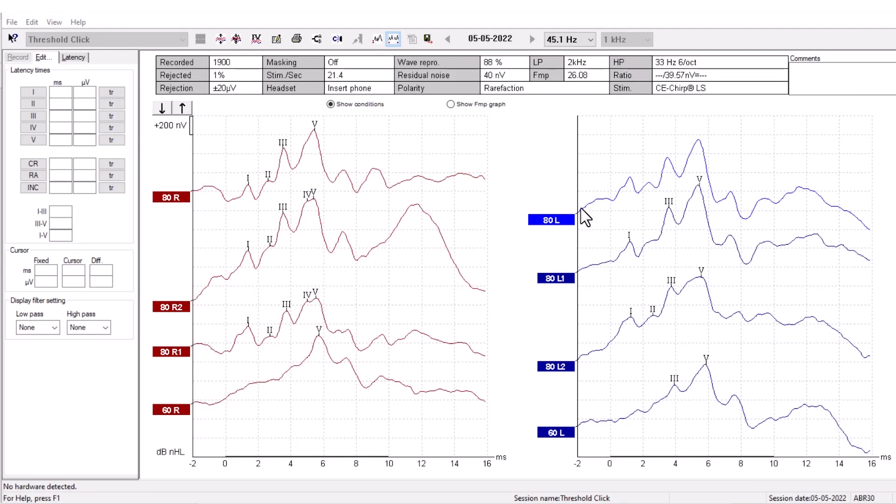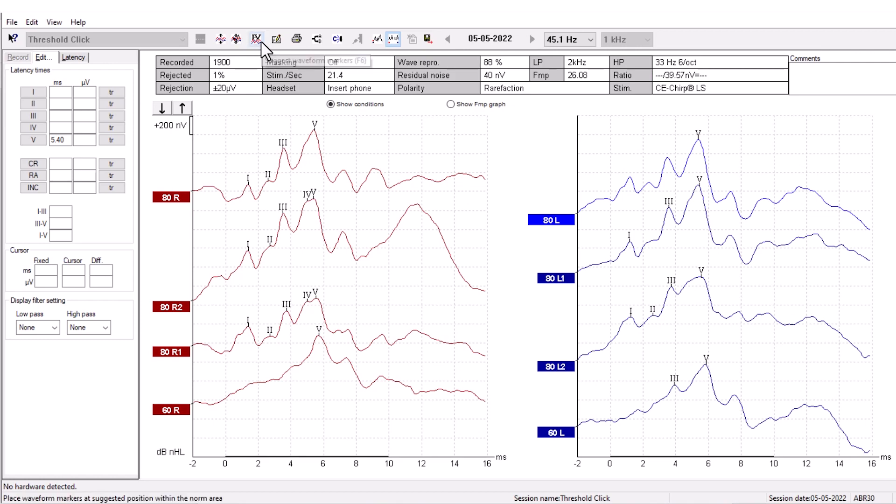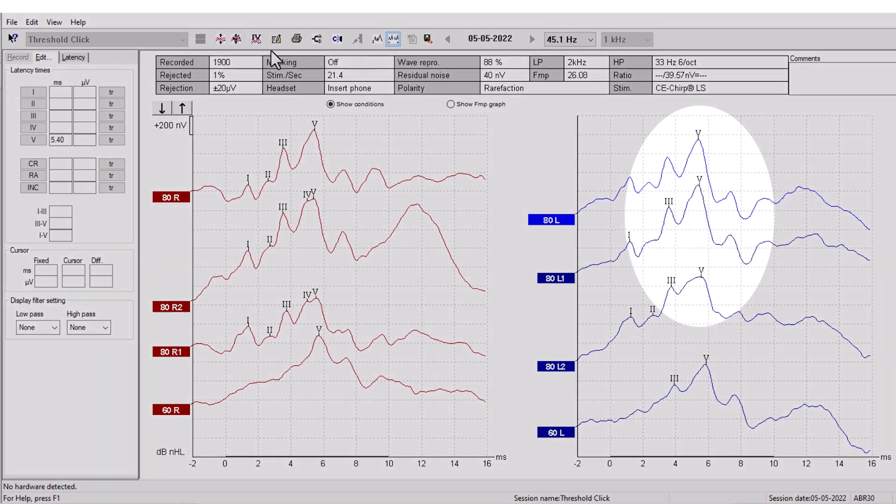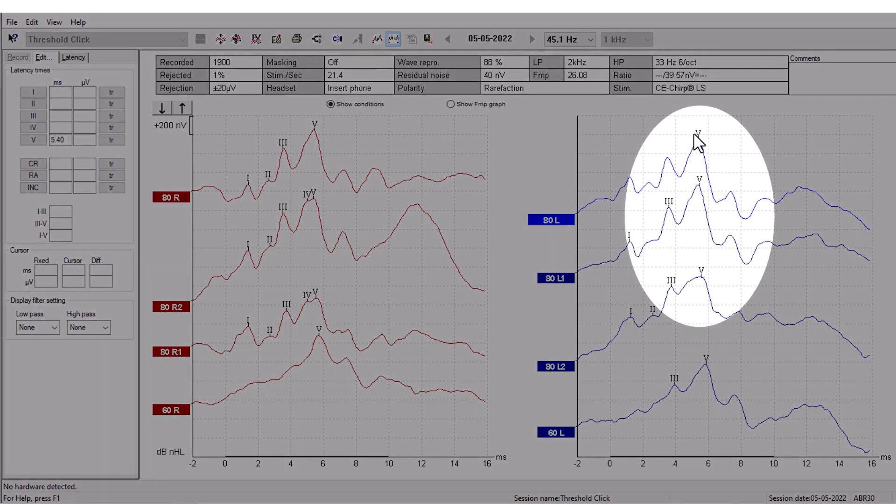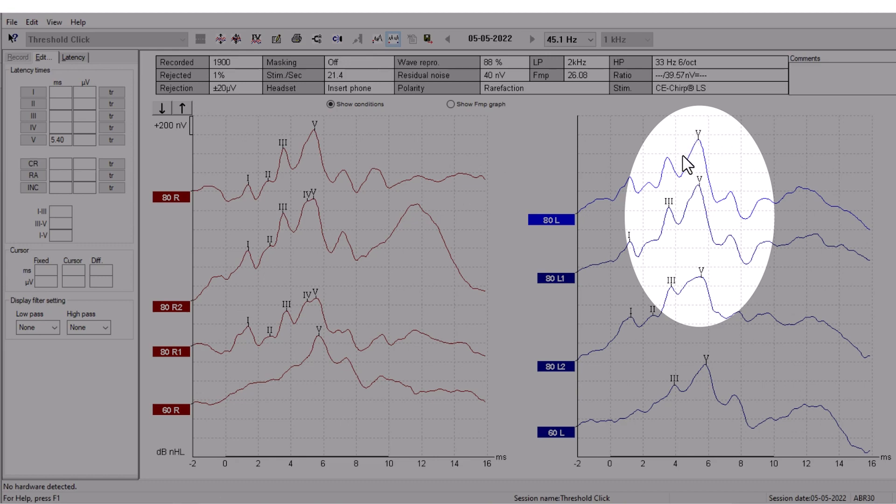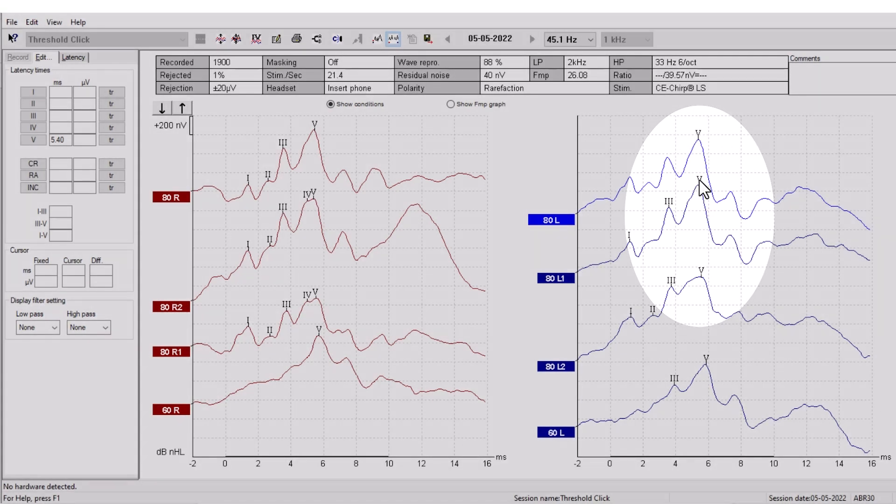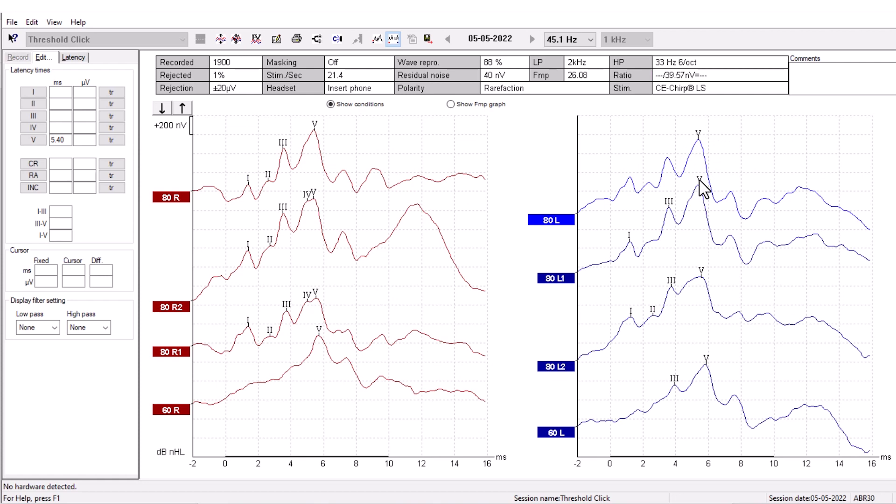Some ABR measurements can be hard to read. The Eclipse software can suggest wave markers for you based on the normative data in the software. If you press the Suggest waveform marker, you can see that it places the fifth wave marker. This is only intended as a guideline and not a recommendation.